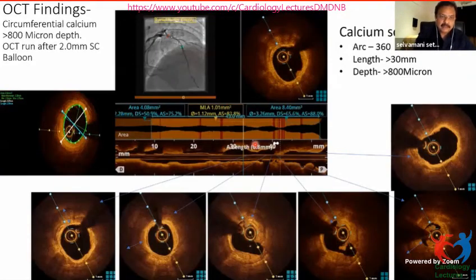After the imaging had been done after a 2 balloon, I wanted to take bigger balloons, like a cutting balloon or a scoring balloon, so that I could dilate. But unfortunately, nothing could be tracked. The moment we take some bigger size device, it was not going at all. When such things happen, sometimes I couldn't put an OCT catheter or a 2-size balloon also. In such cases, we have no other alternative, we'll have to do a rota ablation.